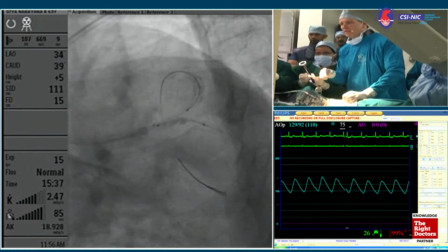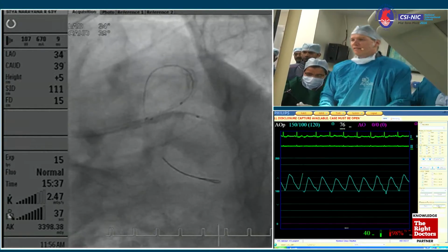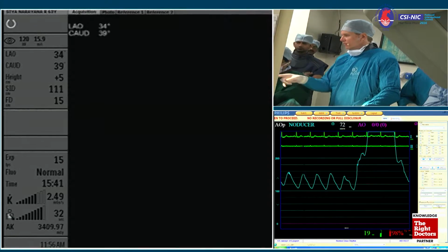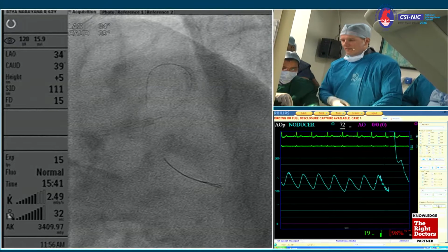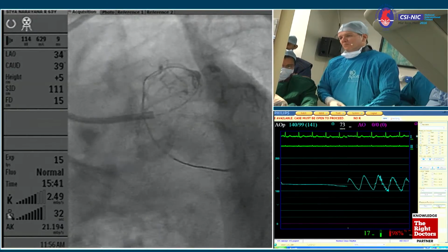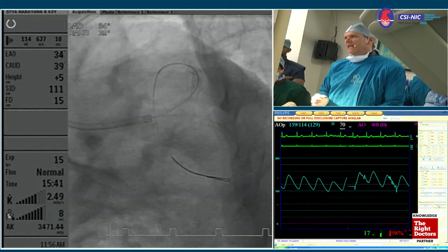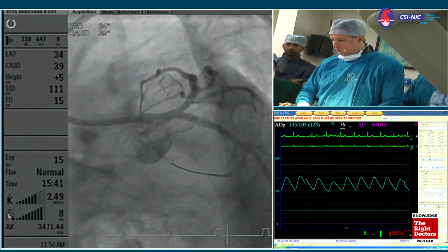So at least we opened, and now we can see if we would like to take a stent in the LAD as well. Let me remove them and do a shot here, so that you see something to discuss. Shot. Injection. Okay, can you inject? Okay, thank you very much. Looks quite good. Looks better. The question is if we need to stent the proximal LAD, which had not much disease. And for this, I would like to take an IVUS and have a look at the ostium of the LAD now.